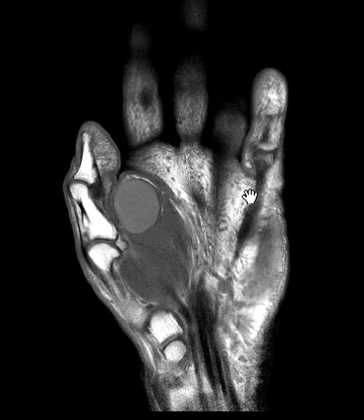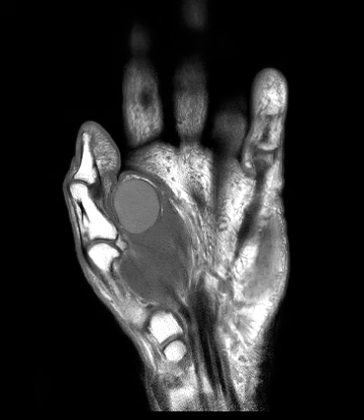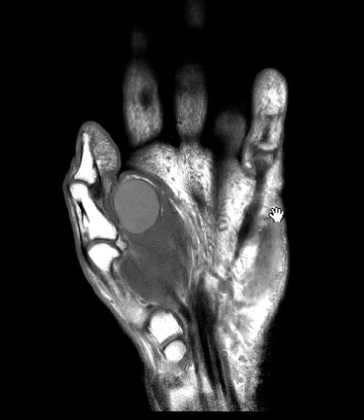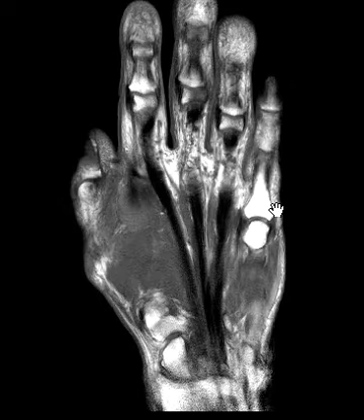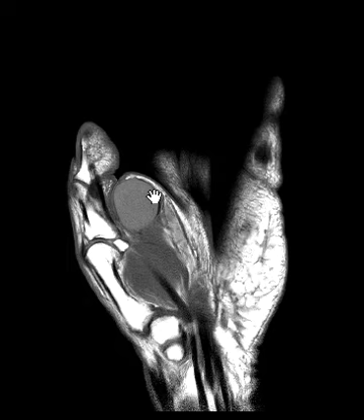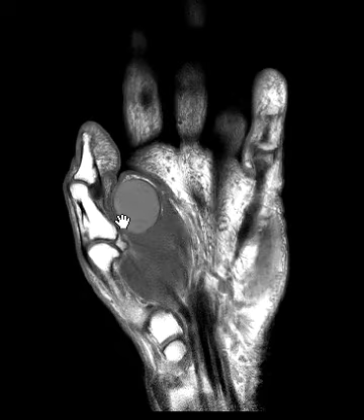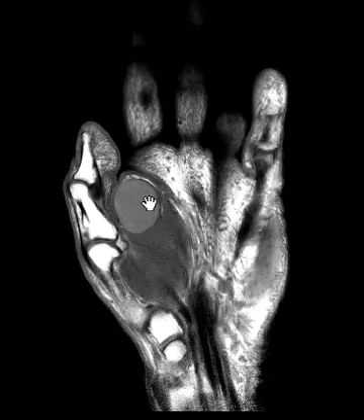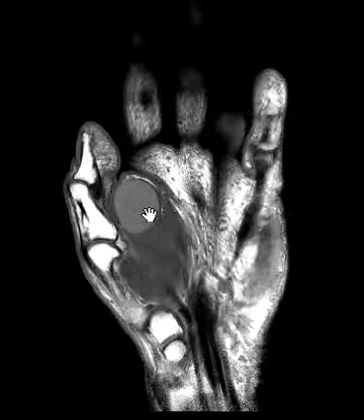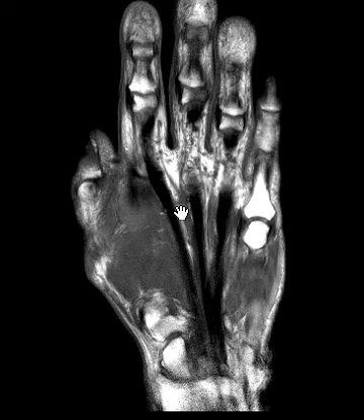Hello, this is Dr. Gay from First Lake MRI, and this is a 68-year-old man who has complaints of soft tissue swelling in the hand. You can see in the distal thenar region, he has this well-defined cystic-looking lesion. On the T1 images, it's hyper-intense to the muscle, pretty uniform in signal intensity.